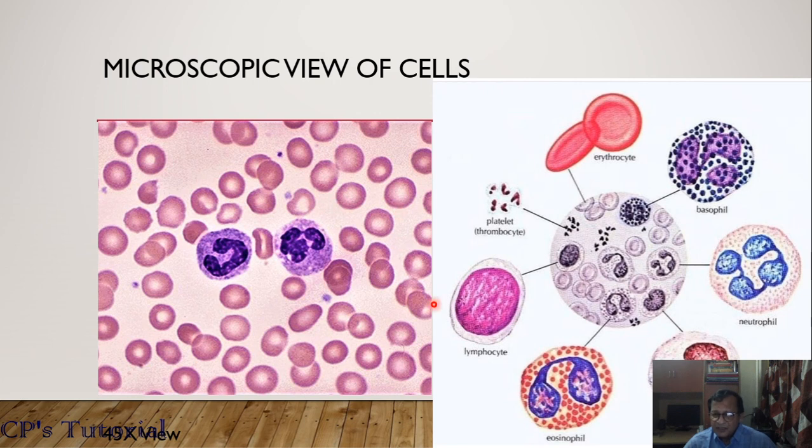If you consider the different types of stainability, the color of the nucleus and of the granules, then you will find each cell under high magnification. Here, a presumptive view has been created for your visual identification. So, identification, the process of smearing and their color reactions I have told to you.